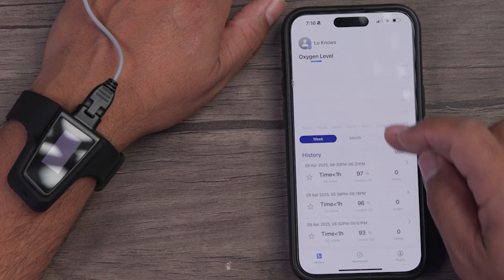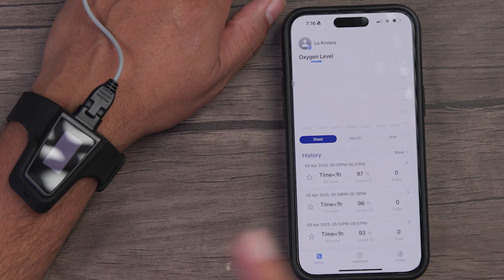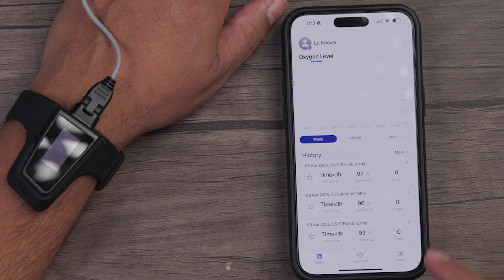You can also check out your history, and it'll create a database of your previous readings so you can get a sense of what's happening over a couple of days of sleep or throughout the day.